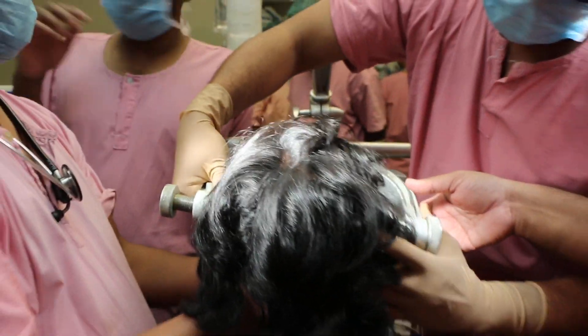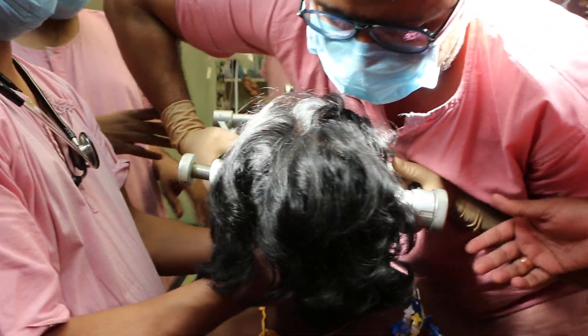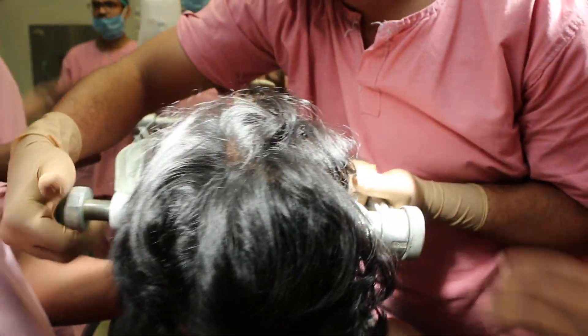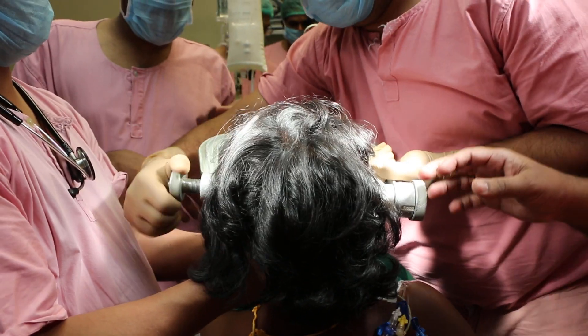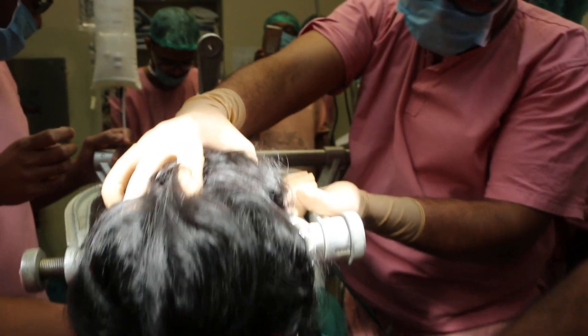Increase this one. ISO. And give the fentanyl. Enough. So the pins are being fixed — Mayfield pins. So you have exposed the shunt part which is here.